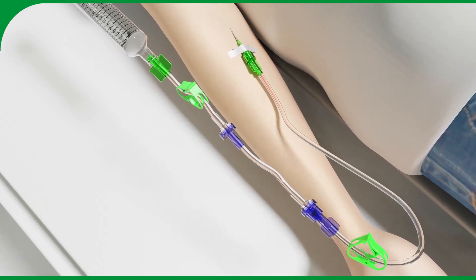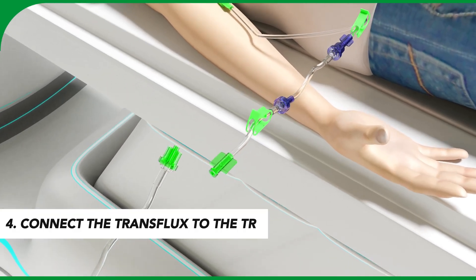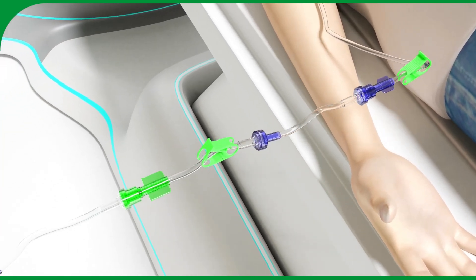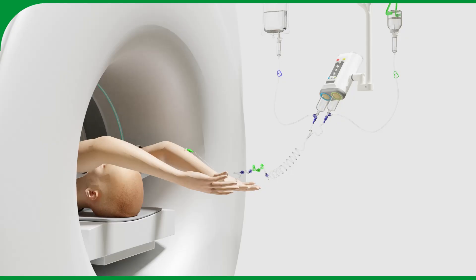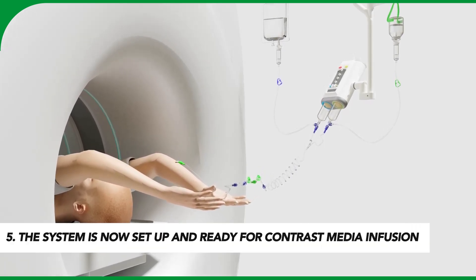After reconnection, connect the trans flux patient line to the trans set filling line connected to the power injector. The system is now set up and ready for contrast media infusion.